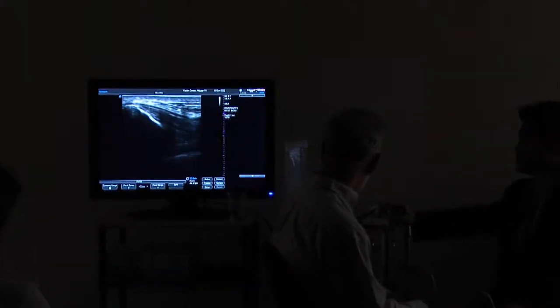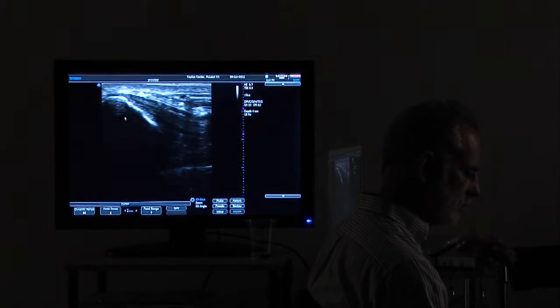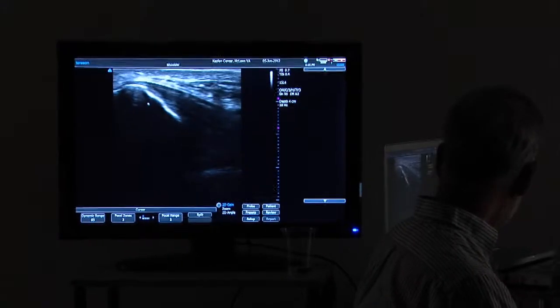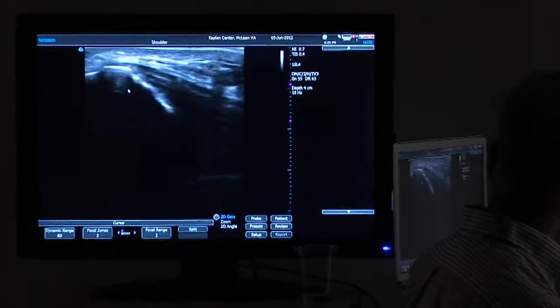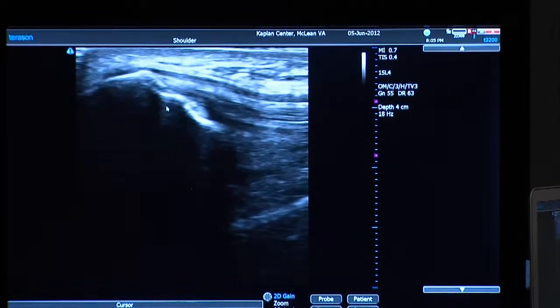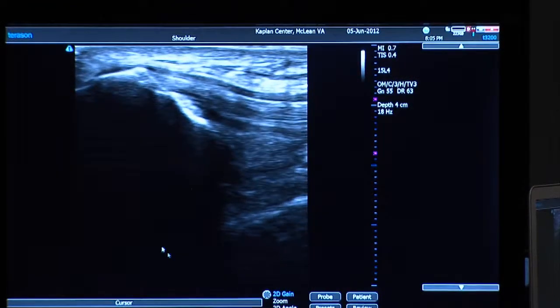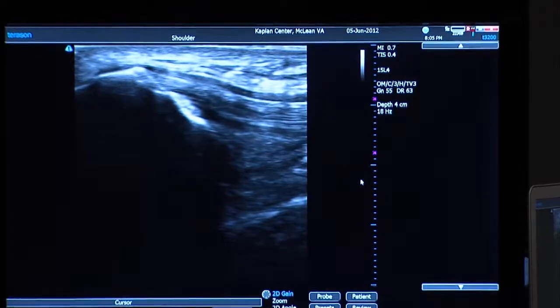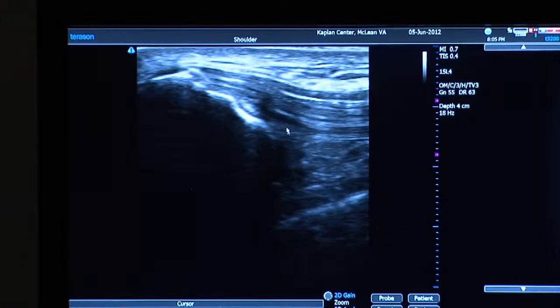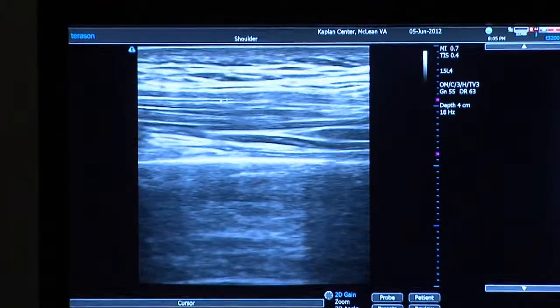Because sound does not penetrate into bone, you can't see anything underneath it — that's why it's dark in there. That is his kneecap right there. The skin surface is here, bone and deeper structures are down here, his feet are towards this direction, and his hip and head are towards that direction.